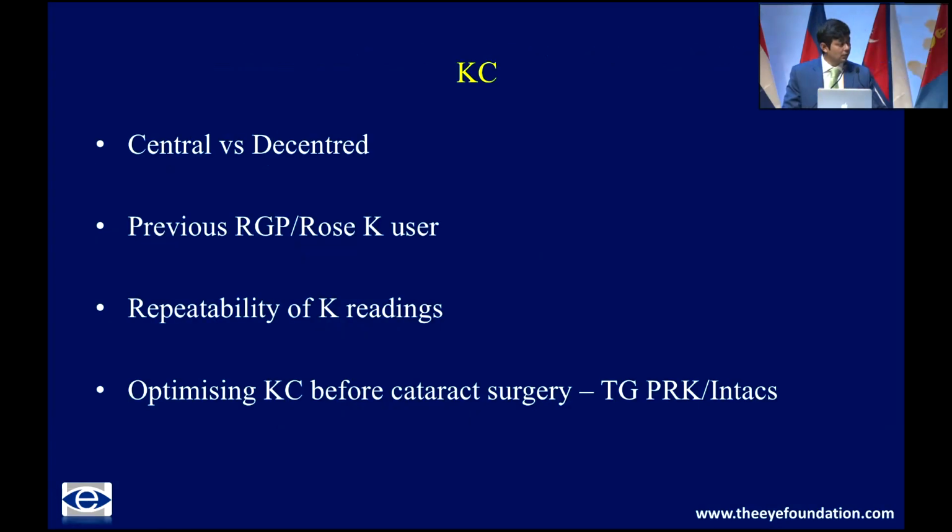Keratoconus is again a very common condition that we encounter in our country, and it's important to differentiate whether the patient was a previous contact lens user or not. If the patient was happy with contact lenses and is willing to wear contact lenses in the postoperative period, it's better that you stay away from any kind of toric IOL. Because once the toric IOL is in place, you have the contact lens, then it will uncover the astigmatism corrected by the toric lens, and the patient will have to wear spectacles on top of that.